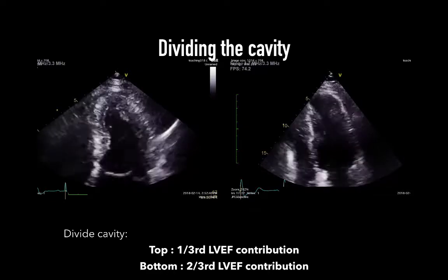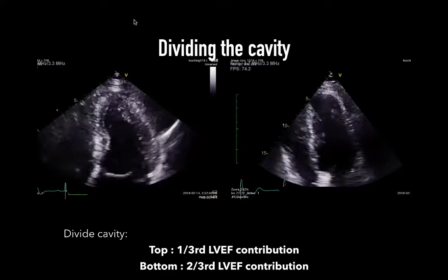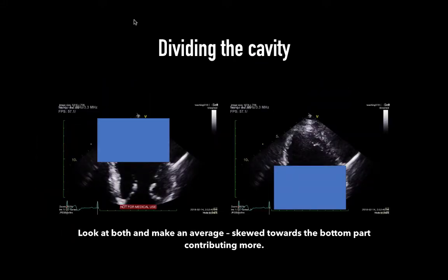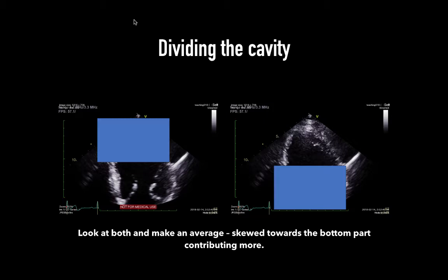In some instances, LV dysfunction might be present in a new form but not always, as shown in the right-sided clip. A quick way to account for this is to divide the cavity into two halves and estimate LVEF separately. The top half contributes roughly one-third of the volume, while the bottom contributes two-thirds. For example, if the apex has an EF of 30% and the base has an EF of 60%, the average would be around 45%, but since the base contributes more, the EF can be edged closer to 50–55%.